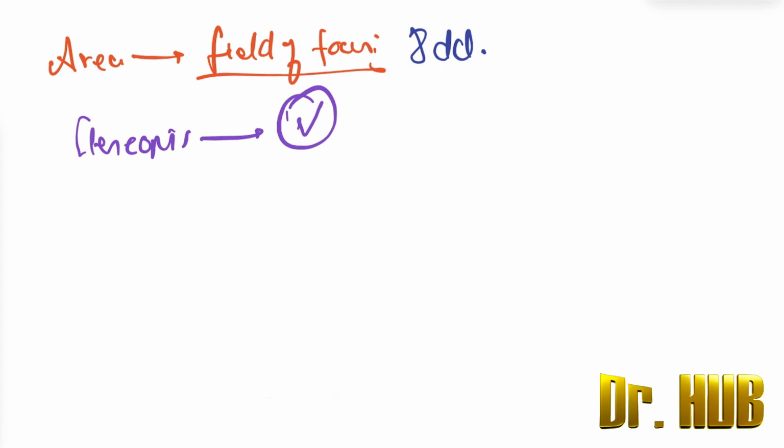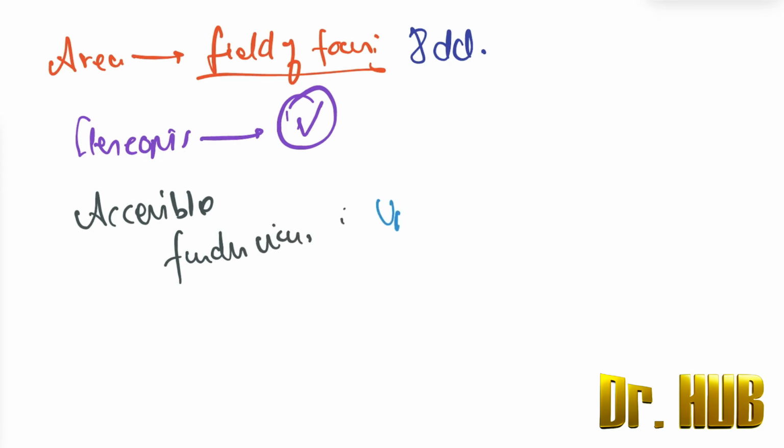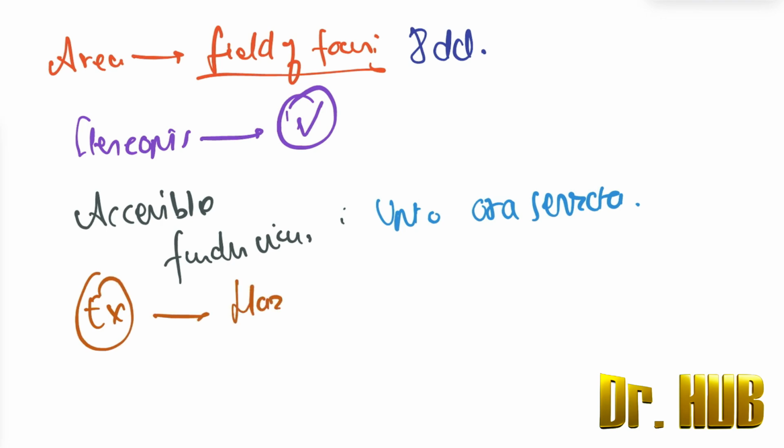And next we see the accessible fundus view. Here it is up to the ora serrata. Then when you look at the examination through hazy media, this is possible.